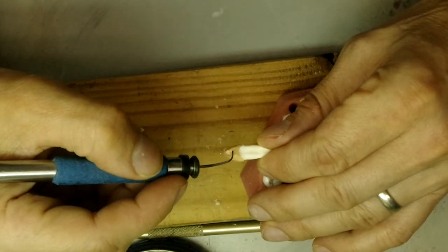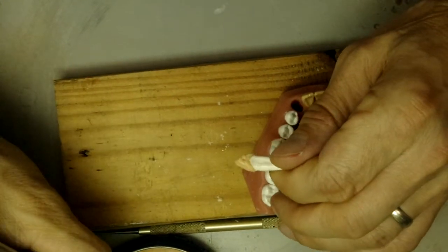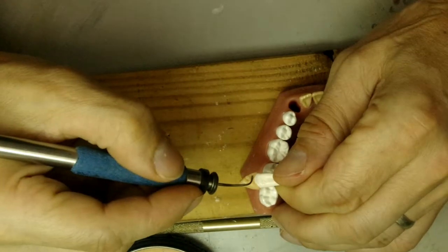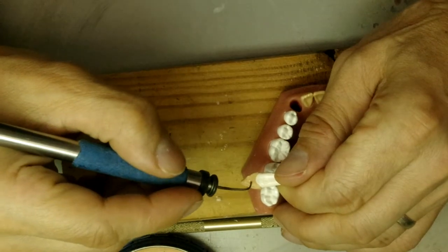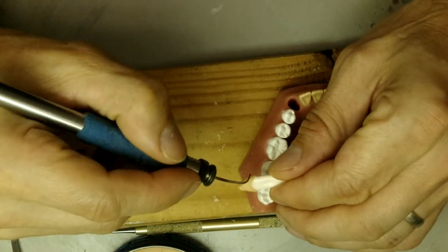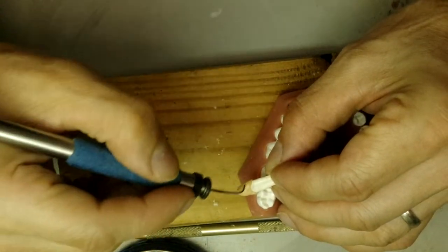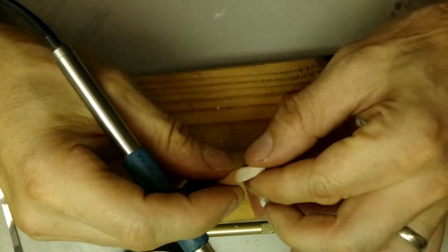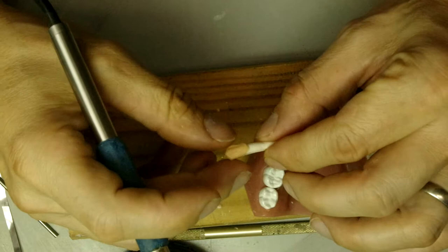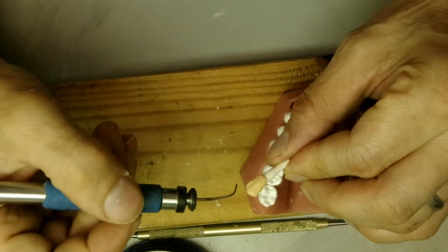A very easy tooth to wax. Not very big, and it's not very detailed. So just pay attention to the shape. The shape is important. So, mesial cusp ridge, distal cusp ridge. Mesial's shorter, the distal's longer.